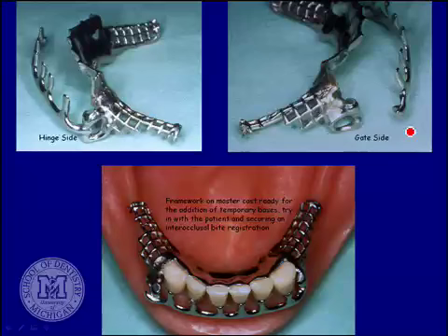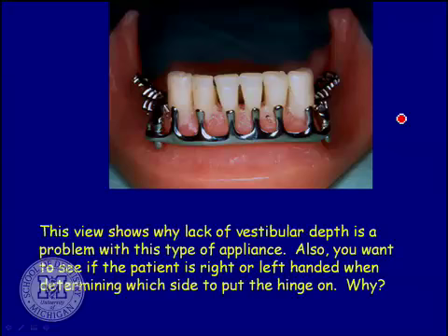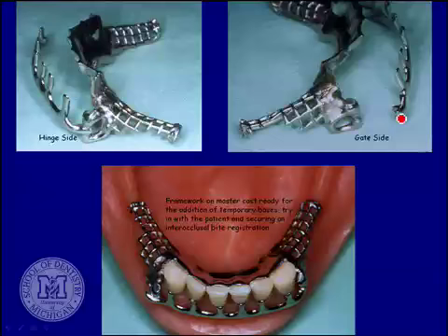Again, this spindle used to go up in the air, up into the surveyor, and the top part of it was cut off. So the only difference is this, instead of being waxed all the way around the spindle, was only waxed part way around the spindle, enough to get a snap fit on it. So the other thing is, because these are totally interchangeable, that is, which side you want to wax it all the way around and which side you want to wax it part way around, you can make these things open either way. It just depends on how they wax them up in the lab.